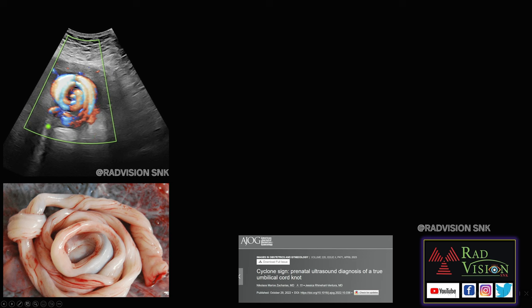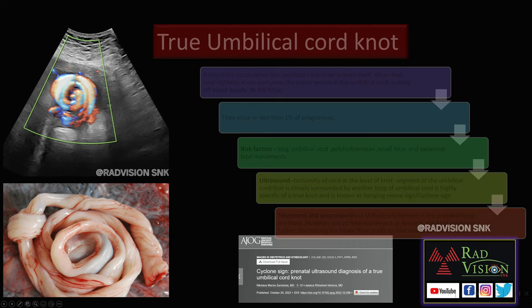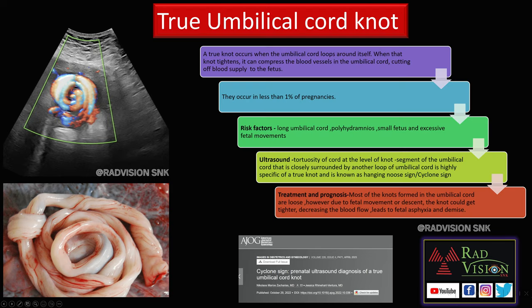Next case: here you can see a tortuous umbilical cord which is surrounded by another loop of the umbilical cord, mimicking the cyclone appearance — also called the cyclone sign or hanging noose sign on ultrasound. This was a case of a true umbilical cord knot, and this sign is called the cyclone sign.